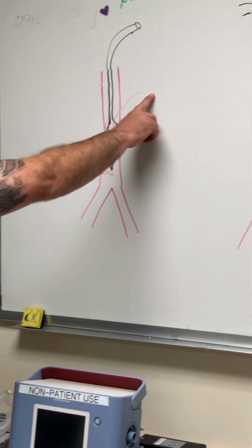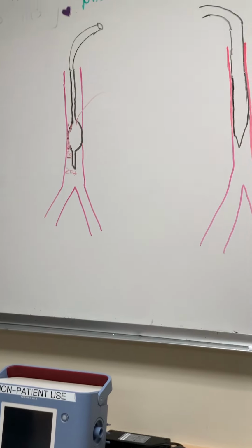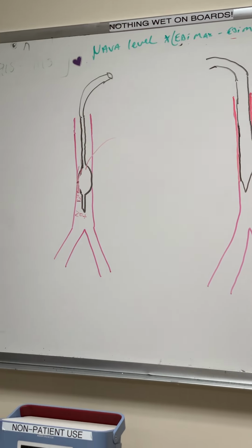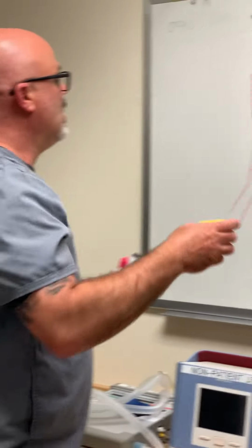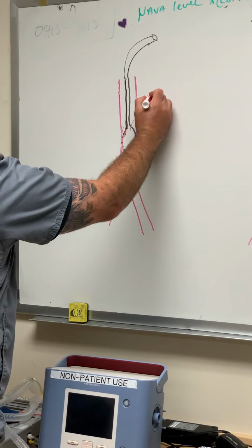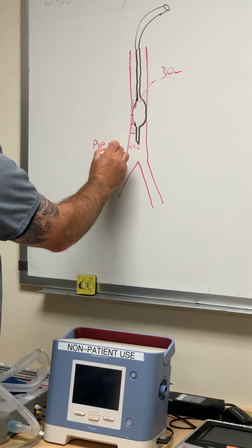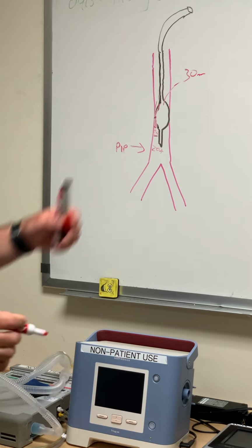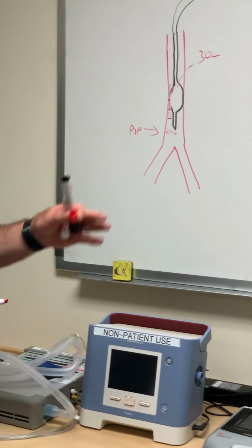So we measure, when it's air filled, what pressure it takes to get that seal to happen. And in most patients, it should be equal to whatever their peak airway pressure is. That's how much pressure in the cuff it should take to seal that. Well, let's say when we're doing this cuff, we have to have 30 centimeters of water pressure in there when our PIP on the vent is actually 20. But it takes 30 centimeters of water pressure in our cuff, as we measure it with our cuffilator, to seal the leak.